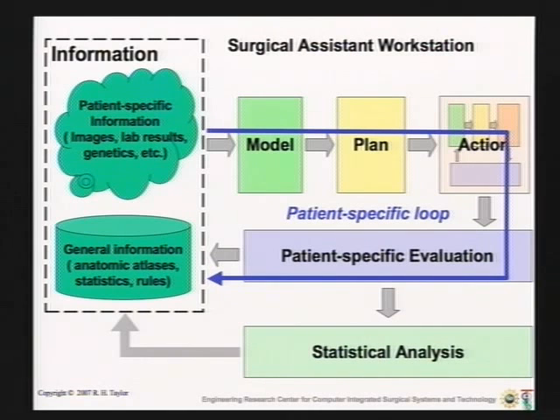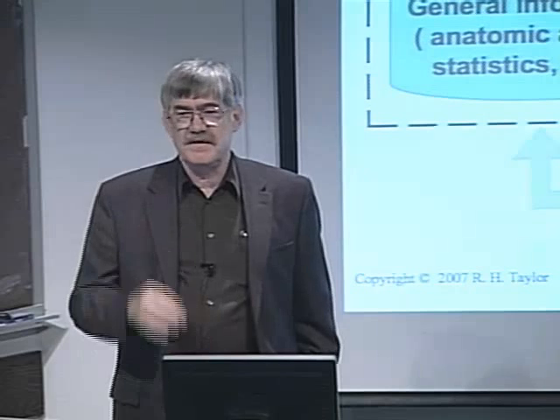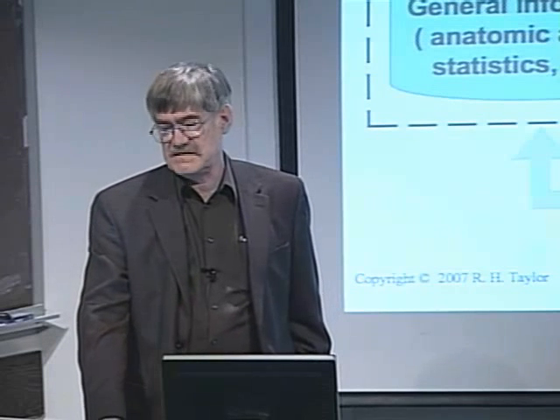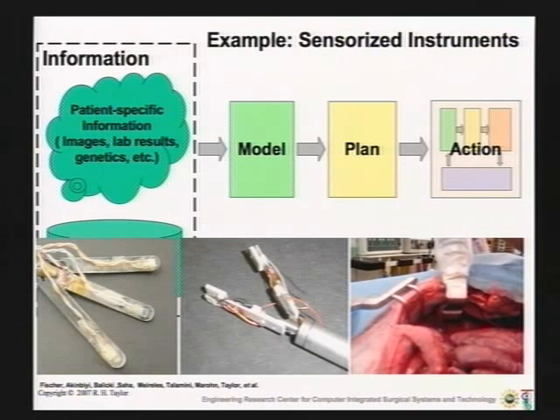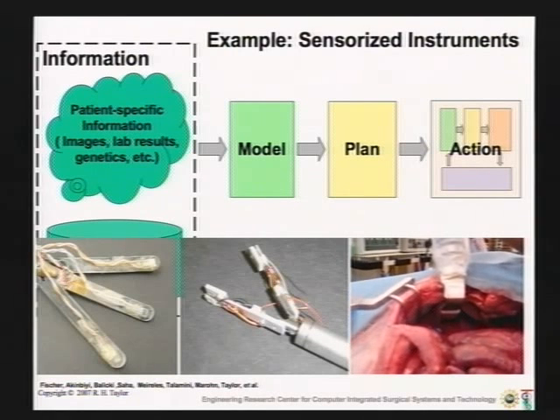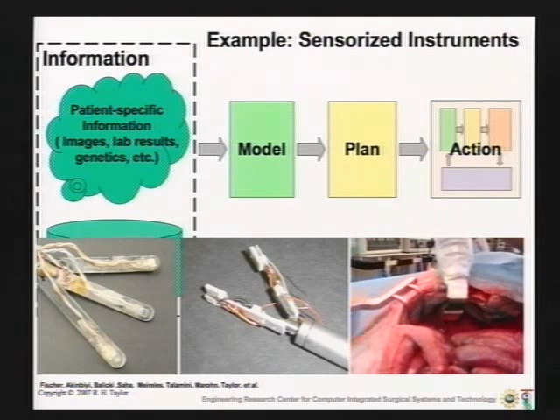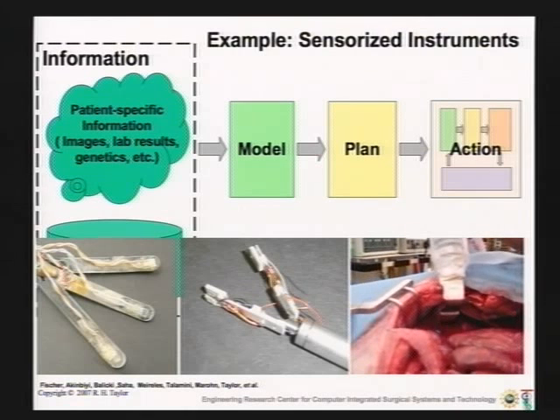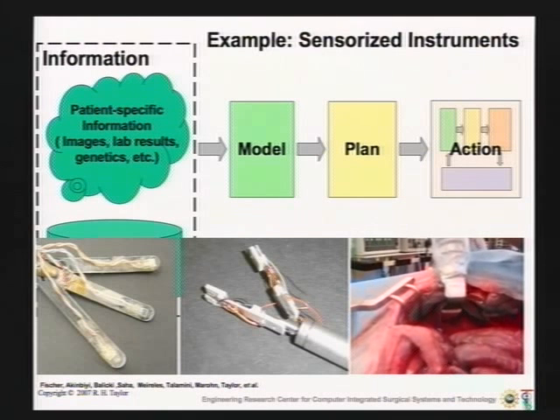You can think of this as the surgical CAD-CAM. I mentioned we also have systems where the decisions are being made much more interactively in the OR, and it's a little easier to think of these as assistants. But again, there's a lot of things. Here, one of the lines of research we've had ongoing for some time has been to make surgical instruments smarter. And these are cases where we've got force sensing, and basically you can think of these as pulse oximeters built down into the business end of these surgical retractors. And what we're trying to tell is, are we retracting so hard that we're interrupting the blood supply?